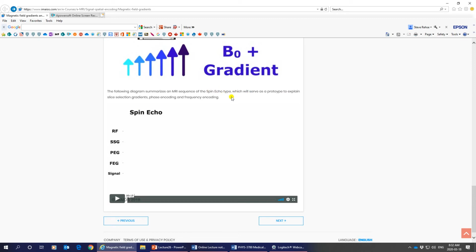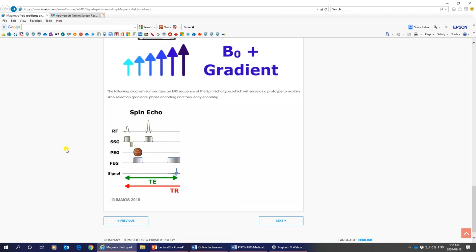Oh, spin echo, you guys know about that. We learned about spin echo last time. So let's just watch how this comes. This is an animated pulse sequence. This is what you've got to understand out of today's lecture, all right? This is how an MR measurement is done.